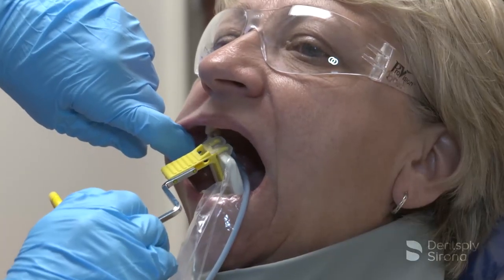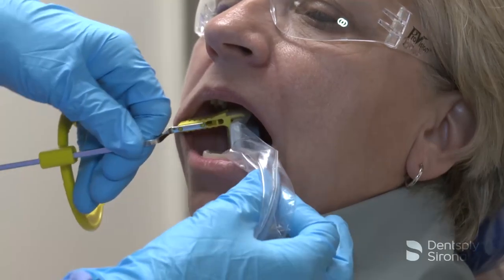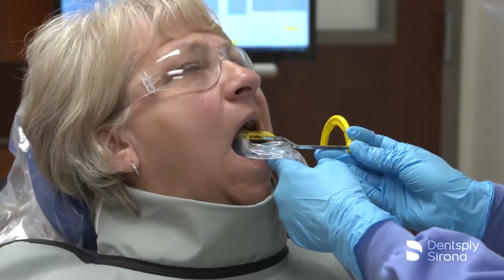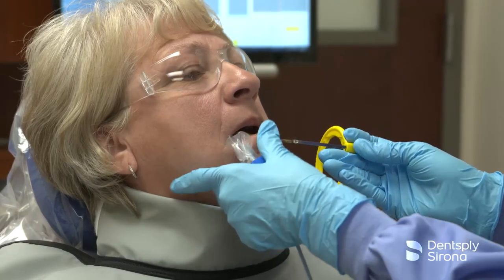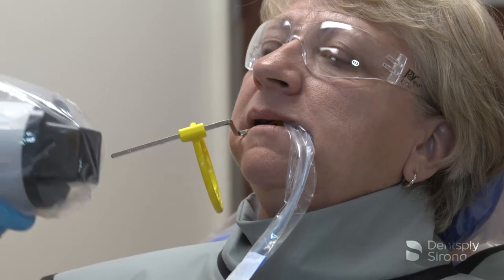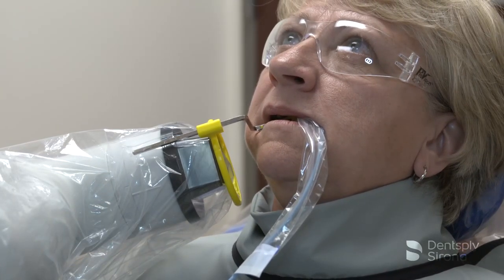The clinician moves to the posterior region of the mandible to capture a periapical of the lower right and left premolars. The sensor is centered behind the second premolar and the mesial edge of the bite block is aligned between the first and second premolar contact area. Due to the inactive portion of the sensor or limited access, a cross-arch placement of the sensor may be necessary to achieve a quality diagnostic radiograph. Once the bite block is in place, slide the aiming ring down, align the tube head, and the X-ray image is ready to be captured.